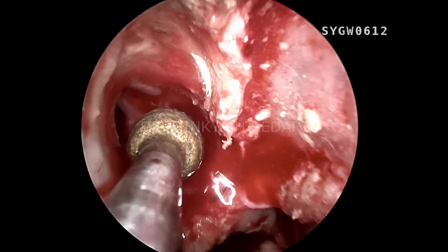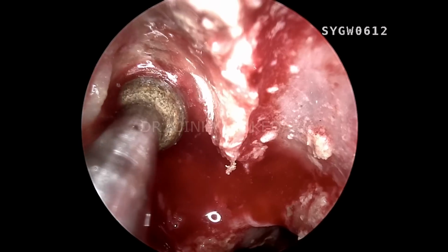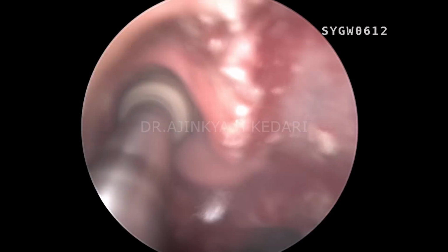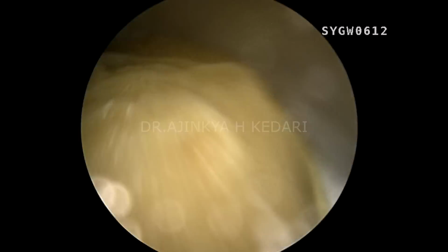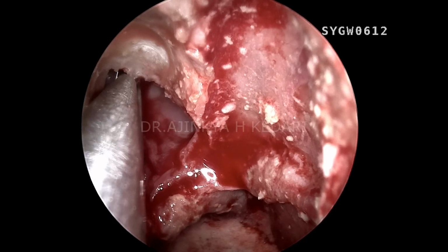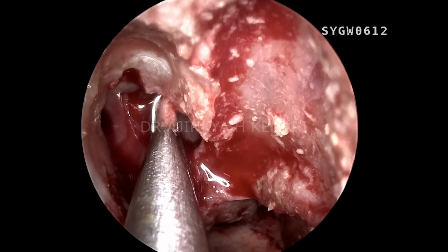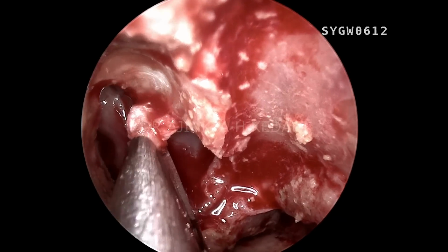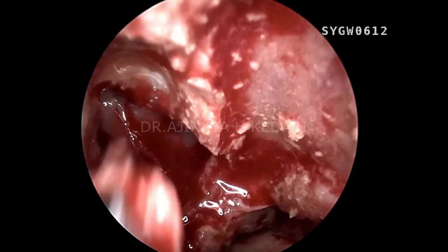With a few cases of Draf 3 or Lothrop procedures, you will definitely come to know the layout of the anatomy. You need to practice initially on cadavers, so you can learn where the anatomy of the lateral wall, the frontal beak, and the posterior wall of the frontal sinus lie.